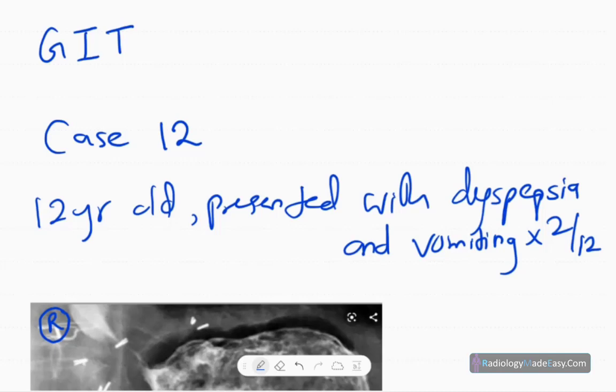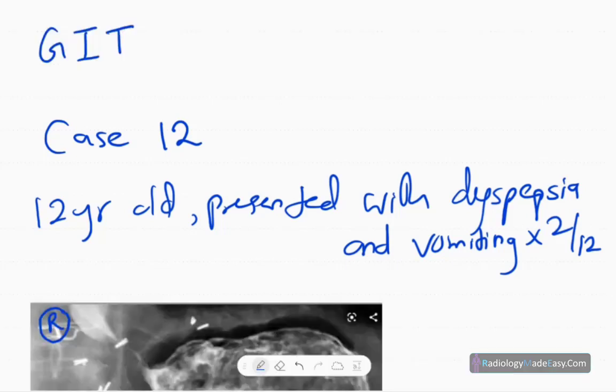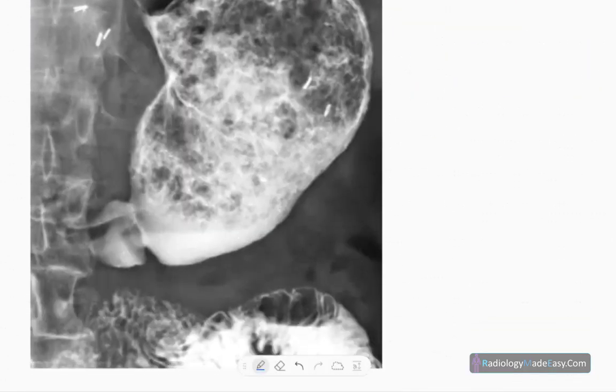Welcome back everyone. This is case number 12 in GIT contrast studies. The patient is a 12-year-old presented with dyspepsia and vomiting for two months duration. This is the anteroposterior spot radiograph in the barium meal series.